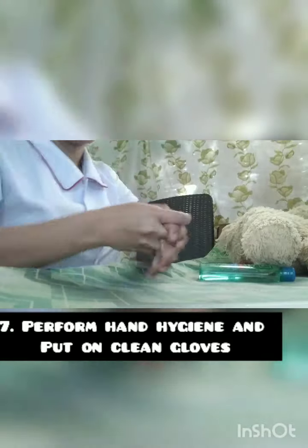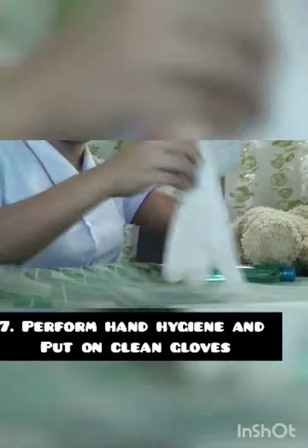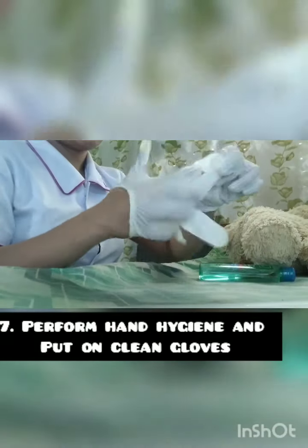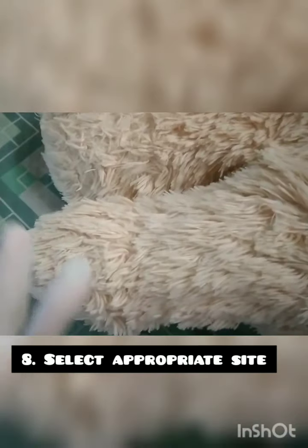Perform hand hygiene and apply clean gloves. This will reduce the transmission of microorganisms. Next, select the appropriate site. Select a site where the skin appears to be healthy and free of irritation and inflammation to reduce the discomfort of injection.